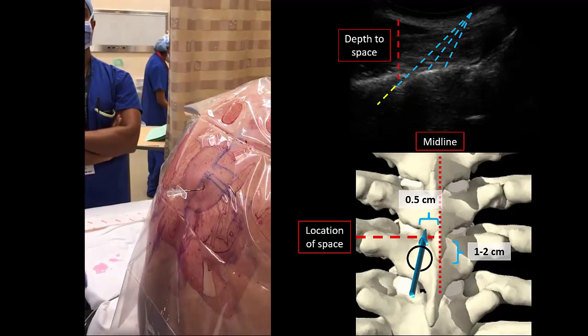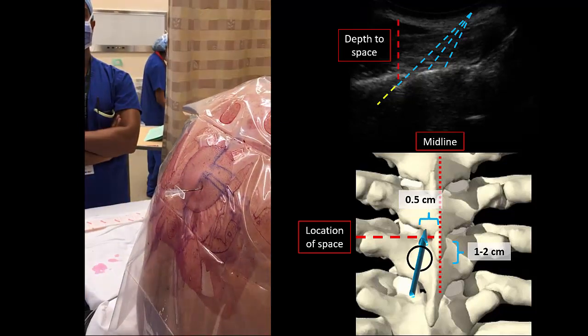Note that loss of resistance in this case is obtained about 2.5 centimeters deeper than the initial contact with the lamina.